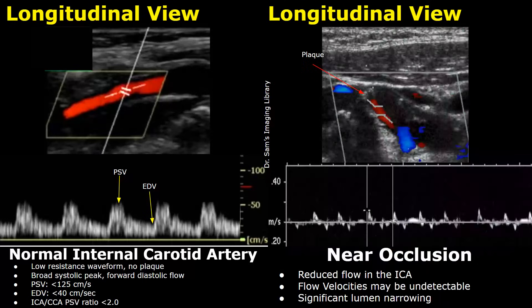Here is a case of near occlusion. There is reduced flow in the internal carotid artery — the flow velocities may be undetectable or greatly reduced. There is also significant lumen narrowing. We can see a very small waveform on spectral Doppler, and this type of waveform may be seen in near occlusion.